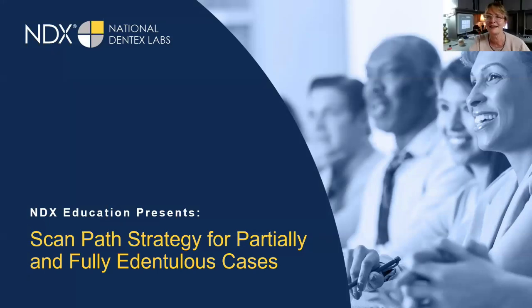Thanks so much, Jessica. And truly, thank Jessica for everything she does. We could not possibly manage all of this without her knowledge and expertise and technological guidance. So welcome, everybody. As Jessica mentioned, please feel free to enter any questions you might have in the chat. I'm all about answering as we're going along. I also want you to know I have a Trios scanner and an Itero scanner here with me. So if there's something that isn't covered in the PowerPoint, we may just shift directly to one of the scanners if you have a particular question, or if it's a little easier to explain some of the new changes with software icons. So let's get started.